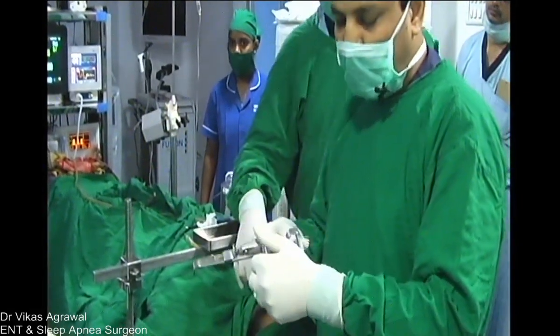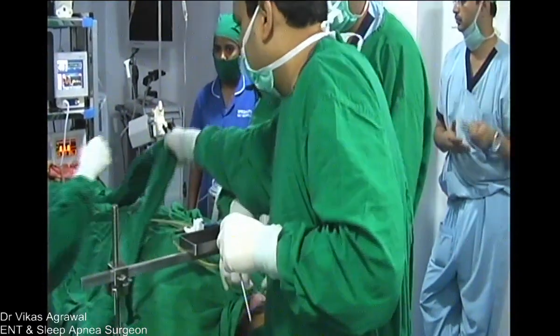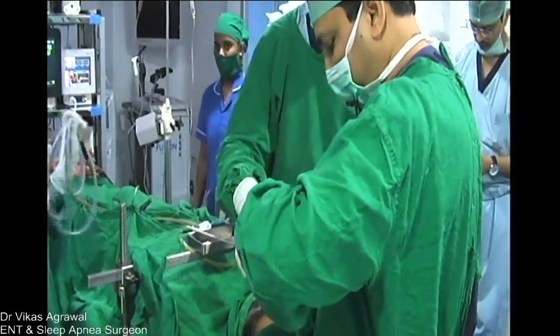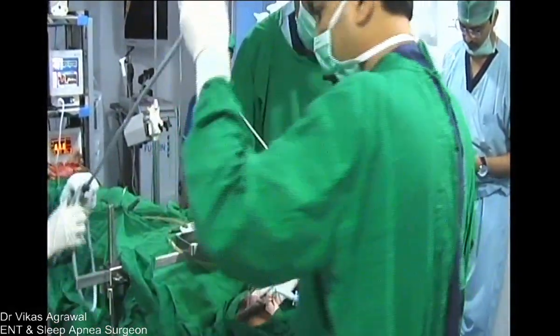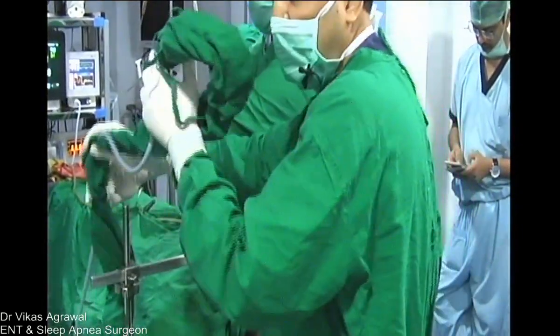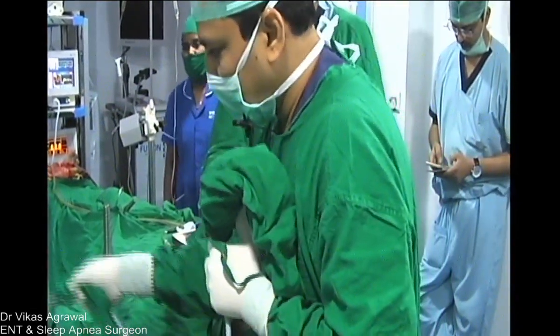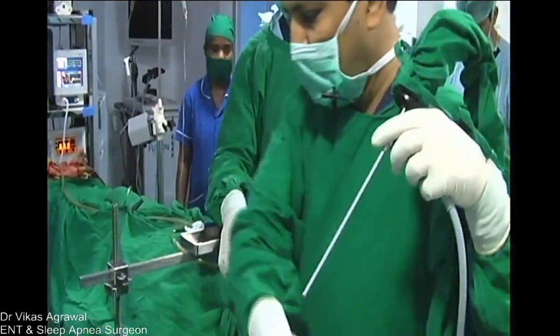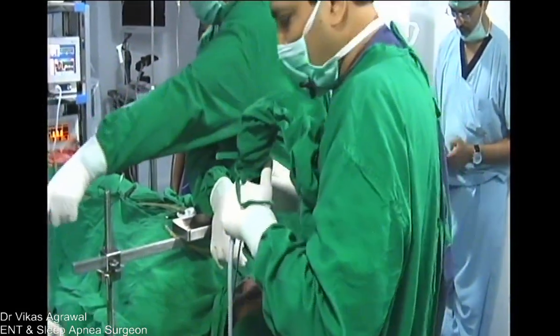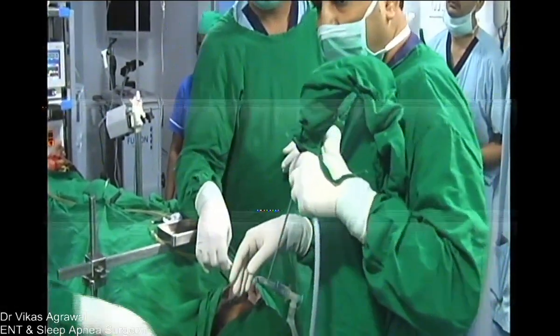We'll see if this works fine. Generally, this is a number 3 mouth gag we use for the tongue base, because if we use a longer mouth gag, it will also press on the base of the tongue. We do not want it to press on the base of the tongue. We are just getting the camera in. Okay, so now we're just getting a 45-degree endoscope because the correct angle is 45 degrees.